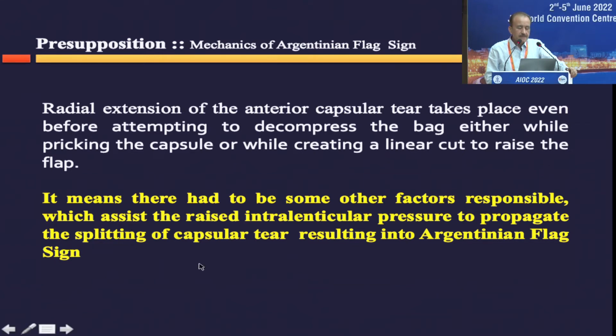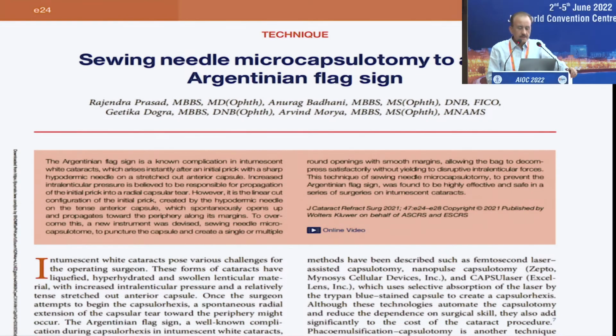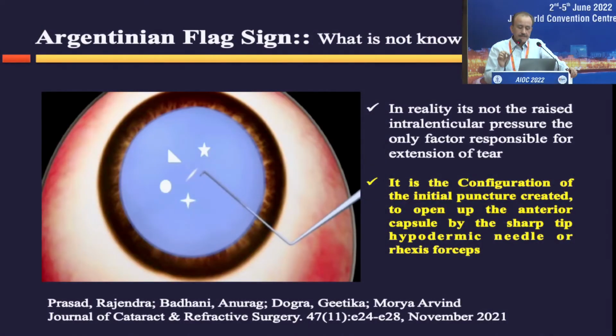And it means there had to be some other factors responsible which assist the raised intralenticular pressure to propagate the spreading of the capsular tear, resulting in Argentinian flag sign. So it's not only the intralenticular pressure, there has to be some other factor, definitely. So we came out with this article, and we did an extensive study on the patients who had the Argentinian flag sign. We reviewed all the videos and saw that in reality it's not the raised intralenticular pressure the only factor responsible for the extension of the tear.